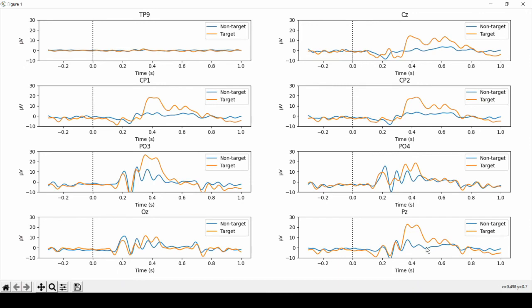The same applies to CP1, CP2, and CZ. As you see here, a nice positive peak starting at around 300 milliseconds, whereas the non-targets remain relatively flat.